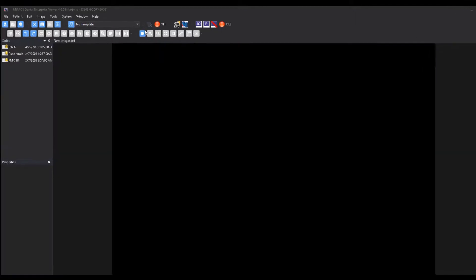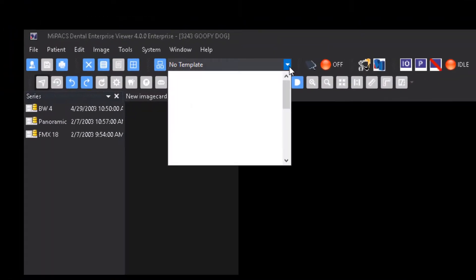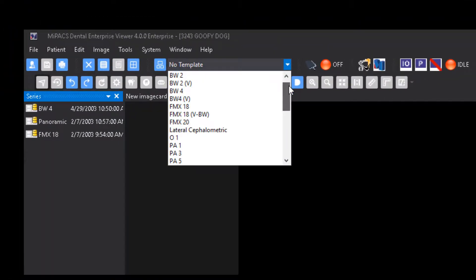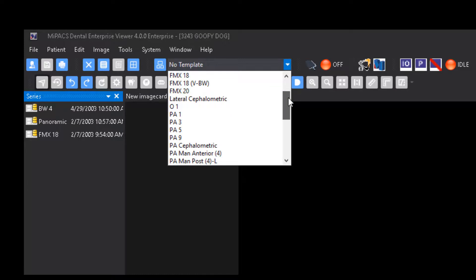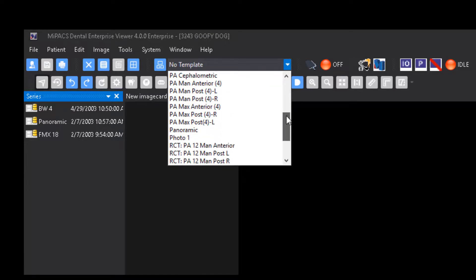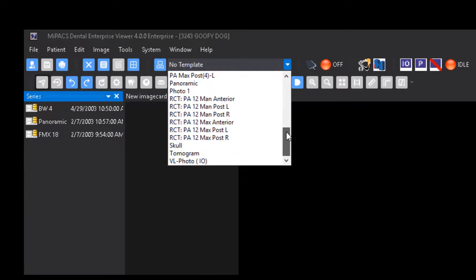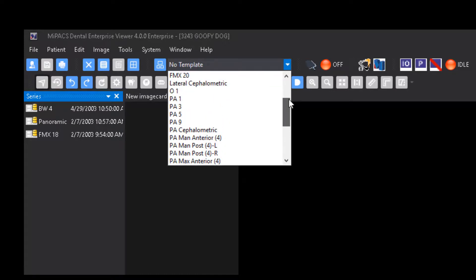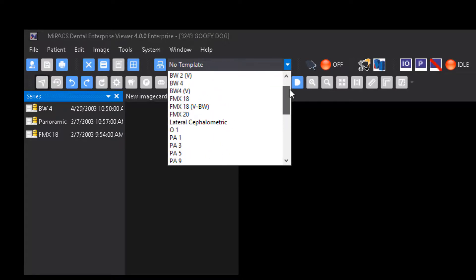Once a patient record is open and you're ready to capture images, you must first select a blank template. Select a template from the drop-down menu and click the Show Template button.